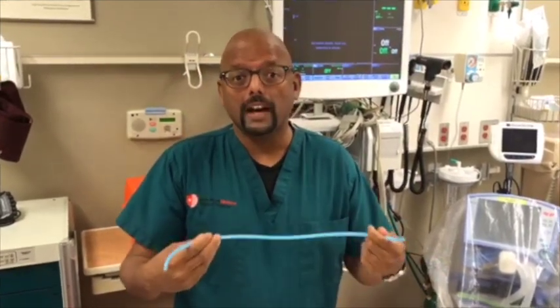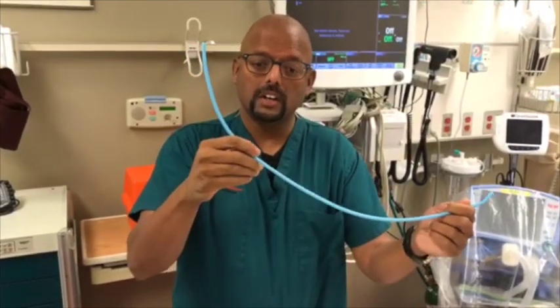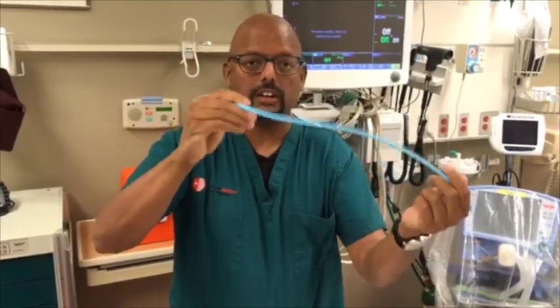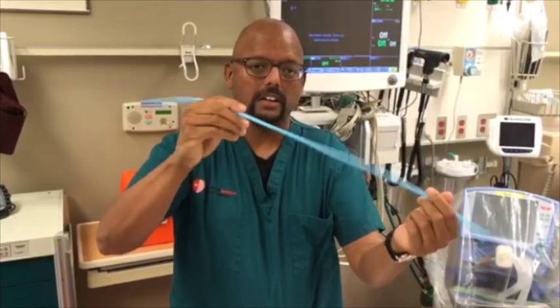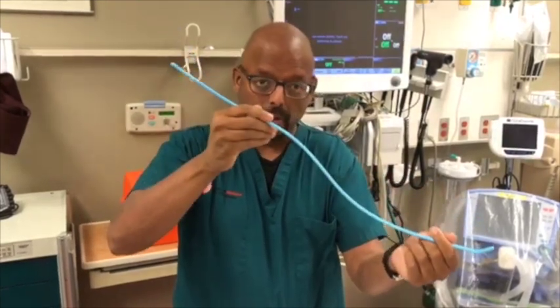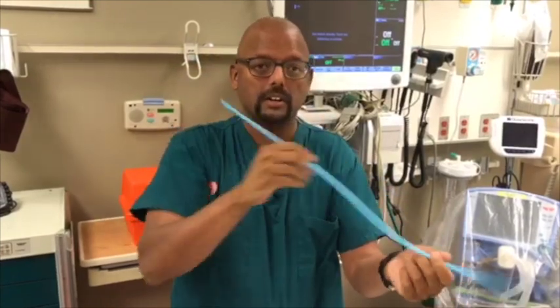What I'm advocating for is what we're calling 'drawing circles.' You hold the bougie in a pencil grip and you turn it — you allow the bougie to turn in your fingers, using your fingers and your hand to make that rotational twisting move. As you're doing this, you're also providing a small amount of downward force so the bougie can clear the obstruction and pass through.